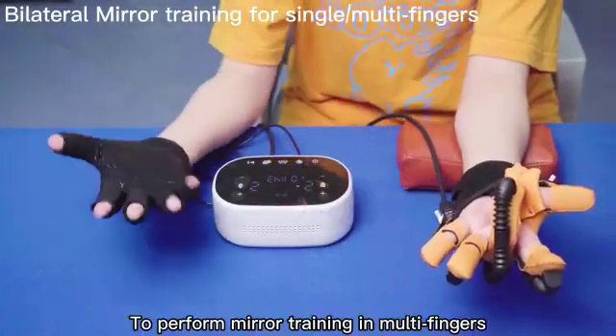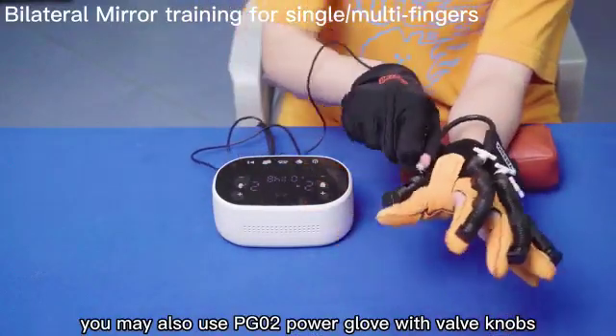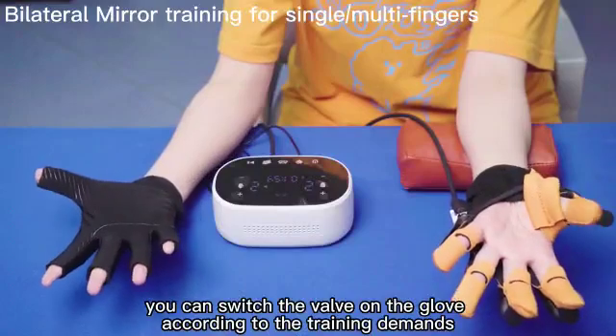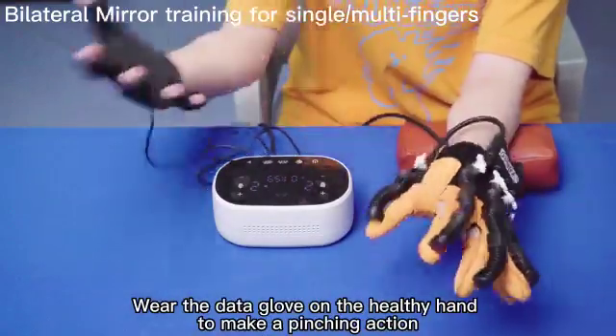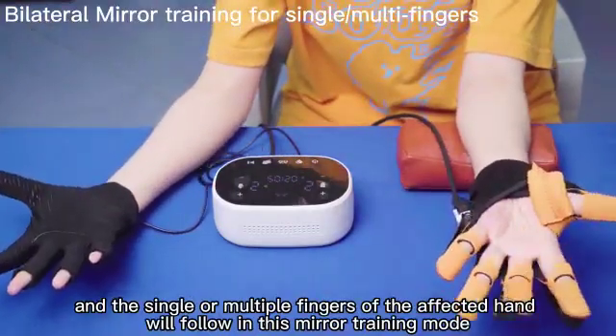To perform mirror training in multi-fingers, you may also use the PG02 power glove with valve knobs. You can switch the valve on the glove according to the training demands. Wear the data glove on the healthy hand to make a pinching action, and the single or multiple fingers of the affected hand will follow in this mirror training mode.